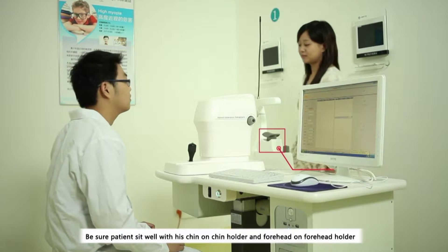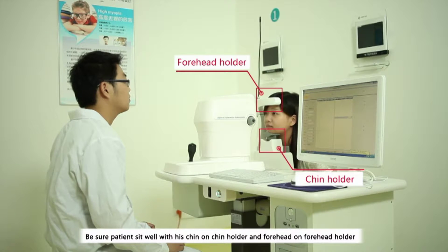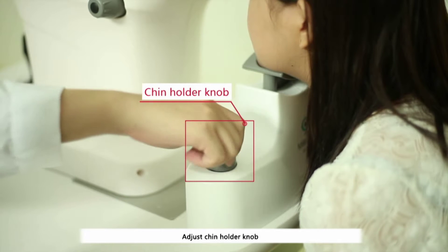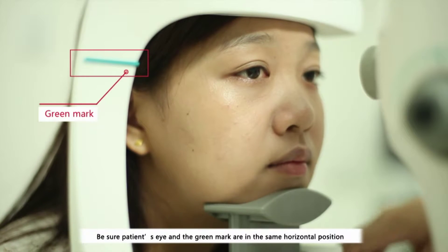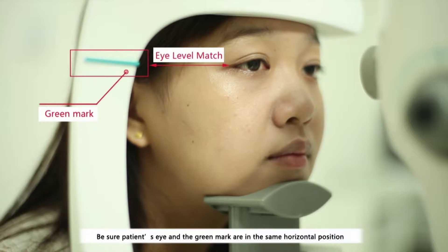Be sure patient sits well with his chin on chin holder and forehead on forehead holder. Adjust chin holder knob. Be sure patient's eye and the green mark are in the same horizontal position.